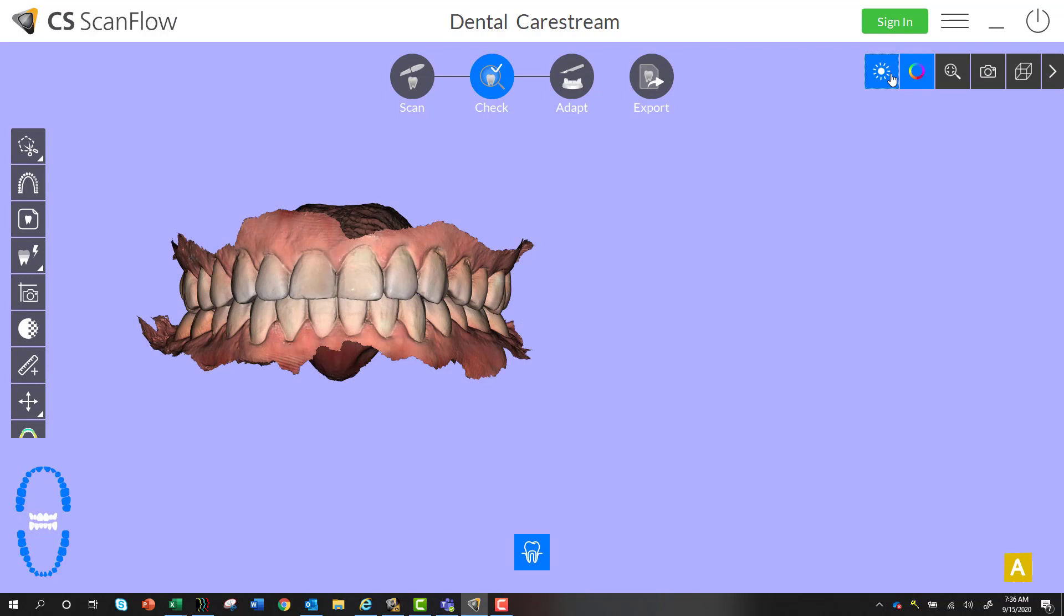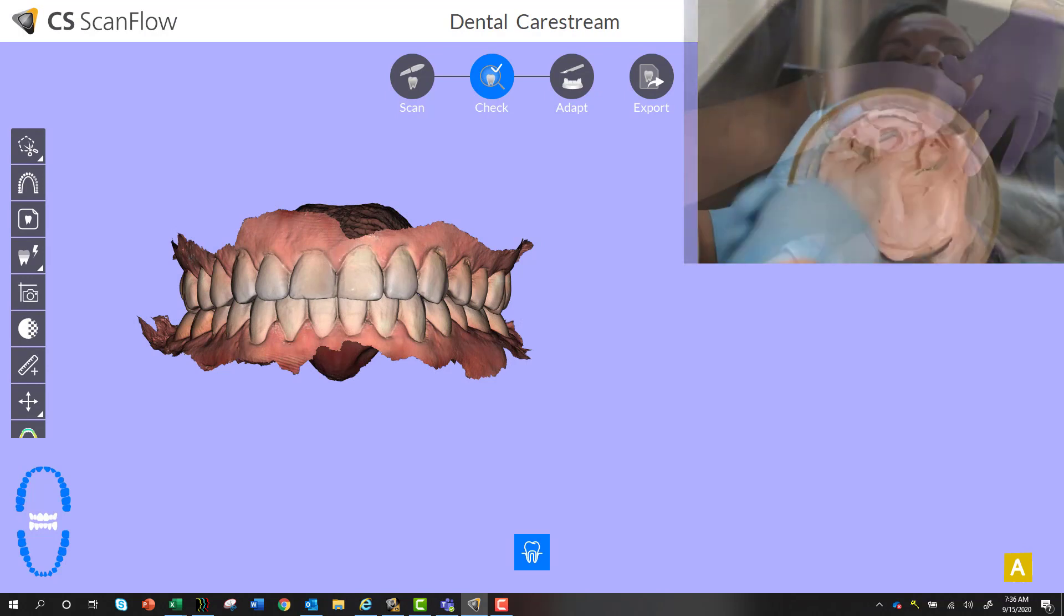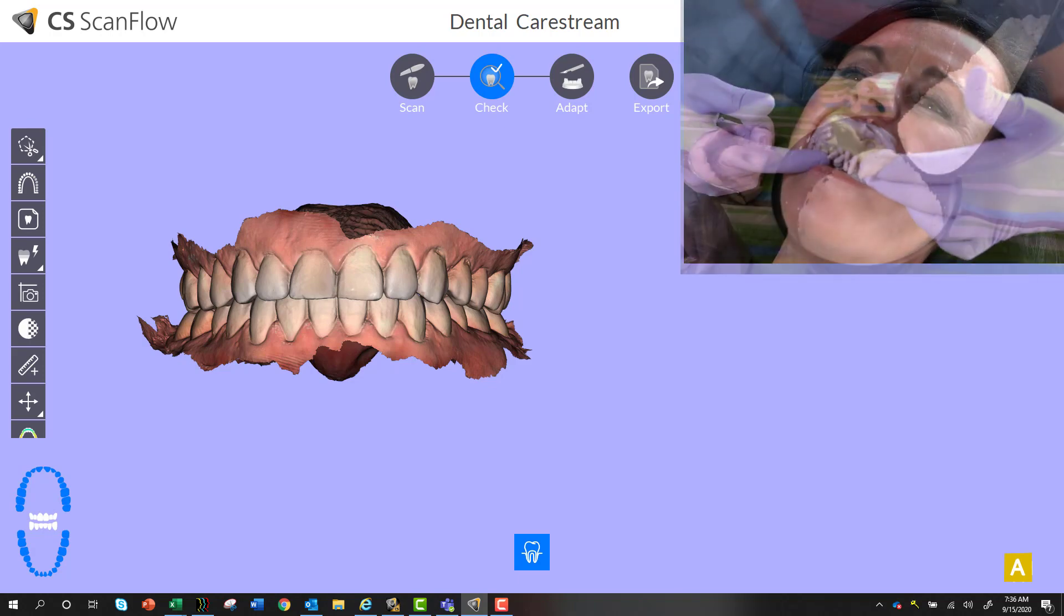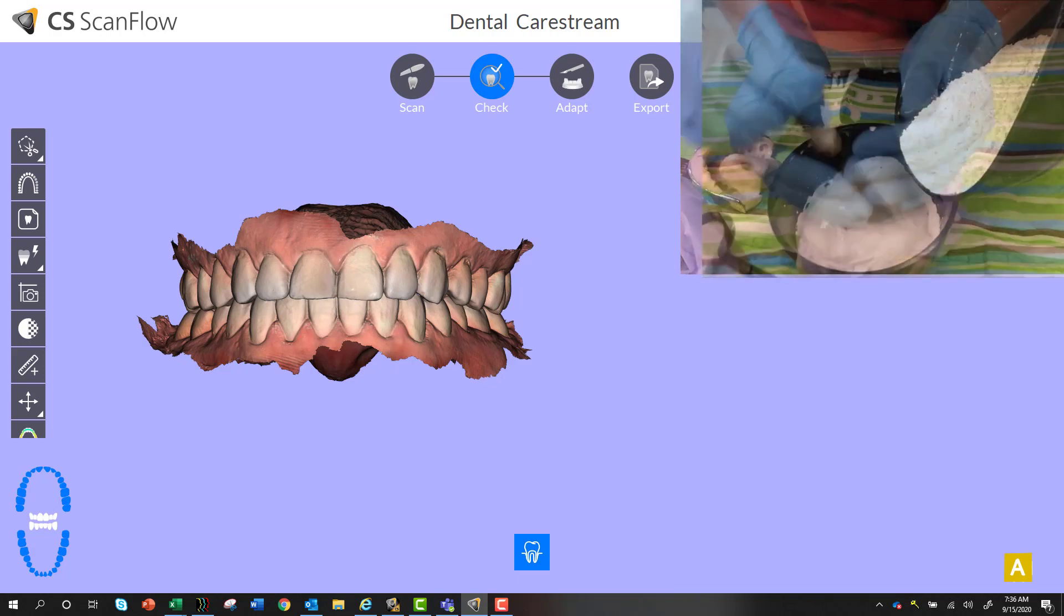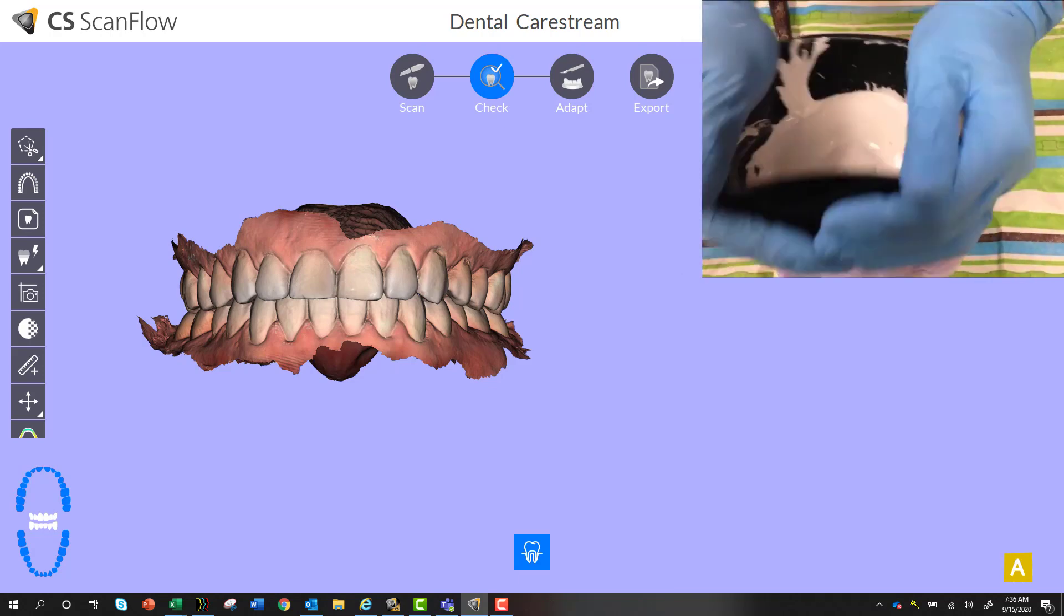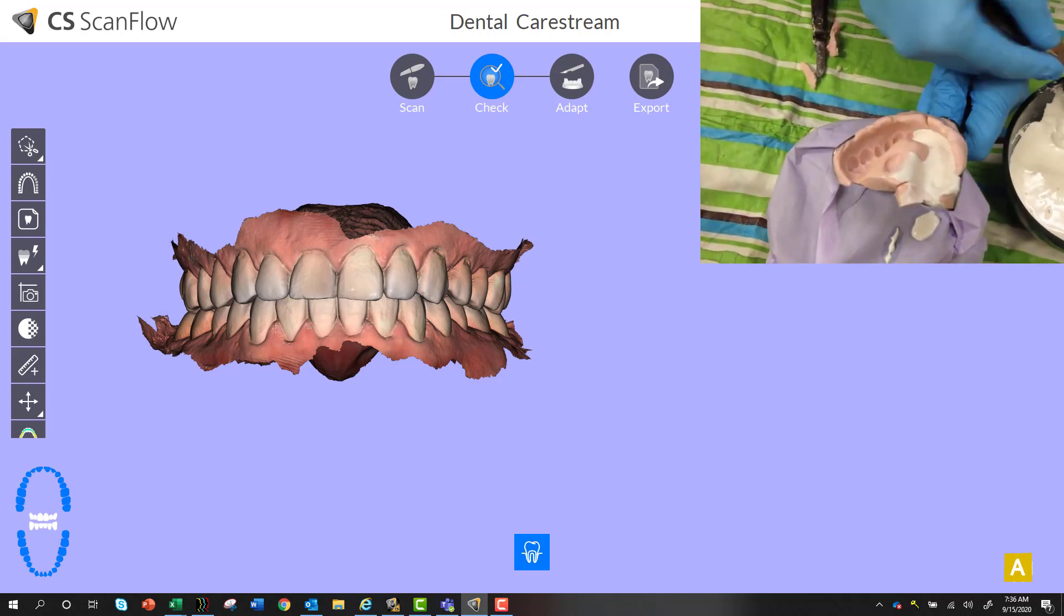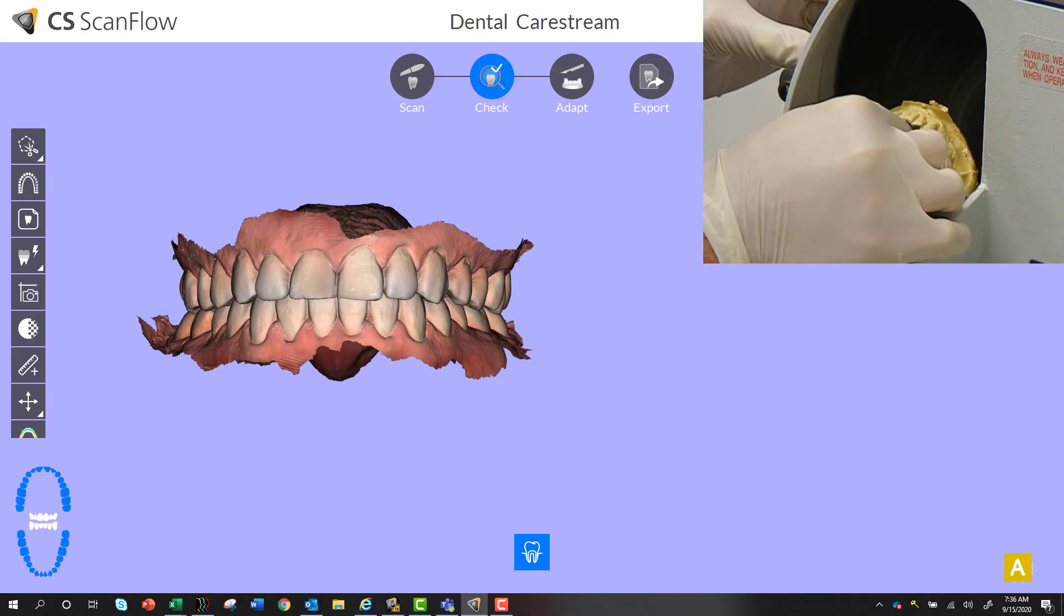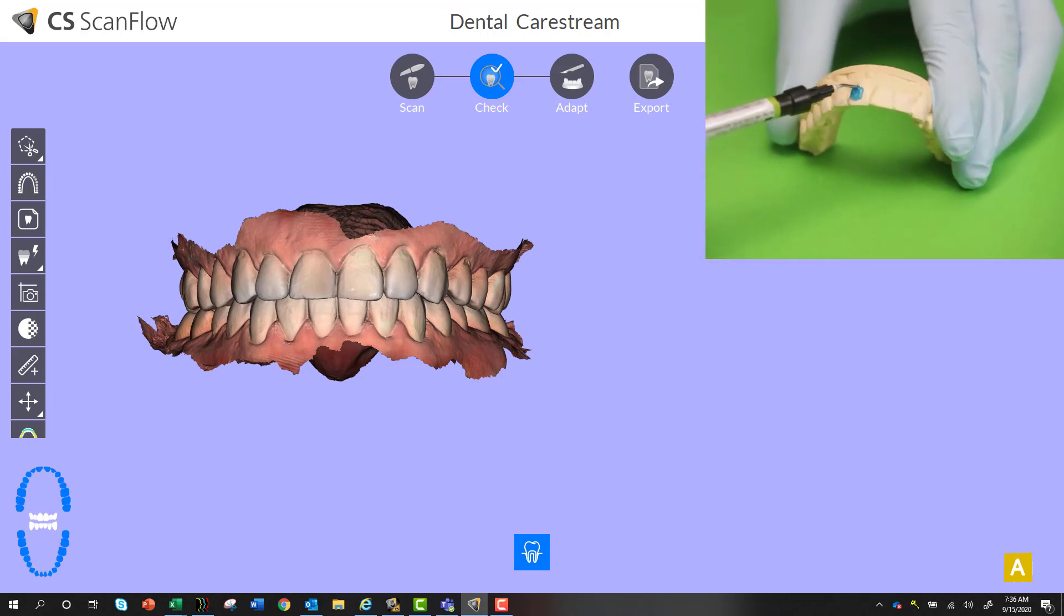Hey what's going on everybody, so I want you to think for a second just how much labor goes into making a bleaching tray conventionally. You can see in the background the steps involved for your assistance and it really is kind of nuts when you think about it. Well, I'm going to show you a better way how to do it digitally and with 3D printing.